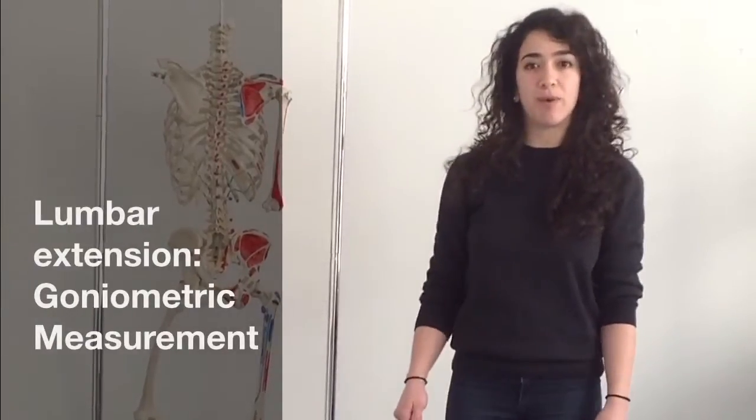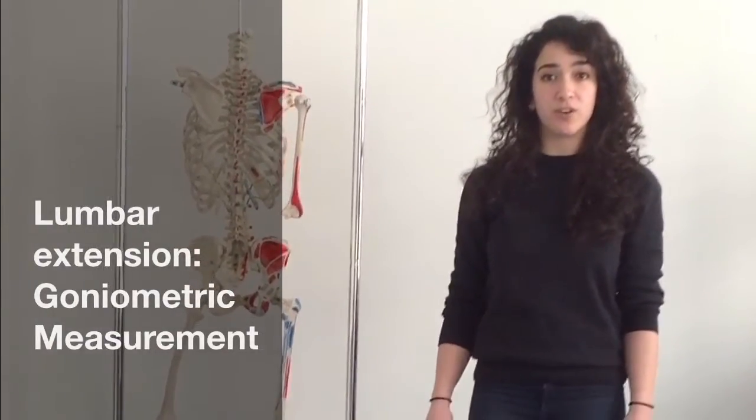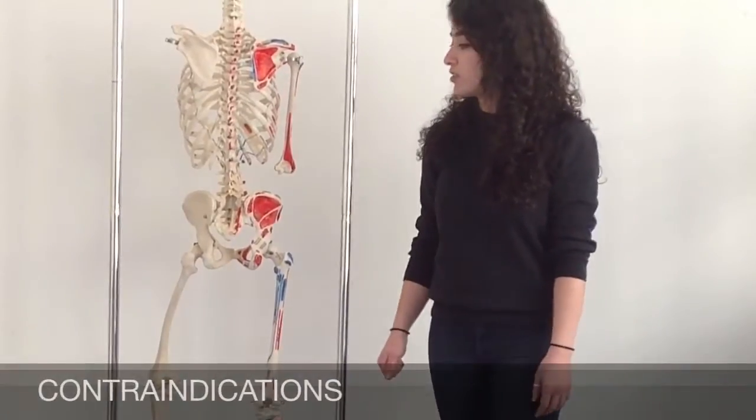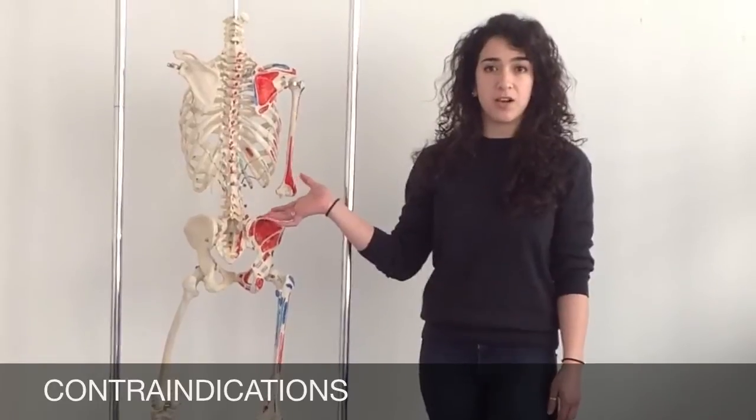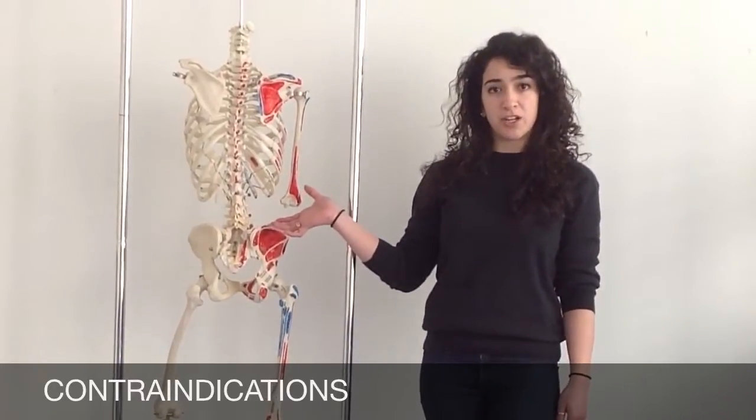Today we're going to talk about how to measure lumbar extension with a goniometer. Contraindications to measuring lumbar extension for your patient are if the patient has pain, numbness, or tingling during lumbar extension.